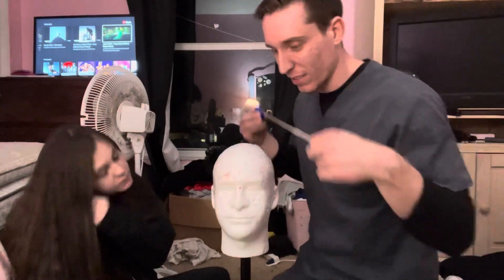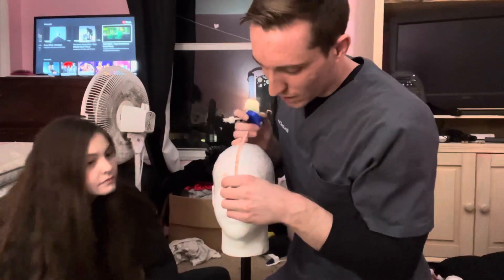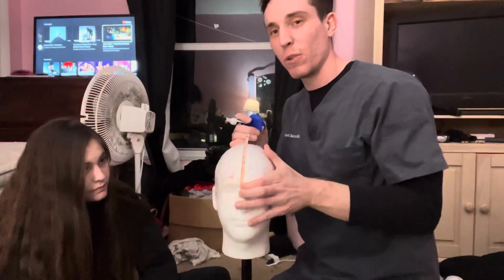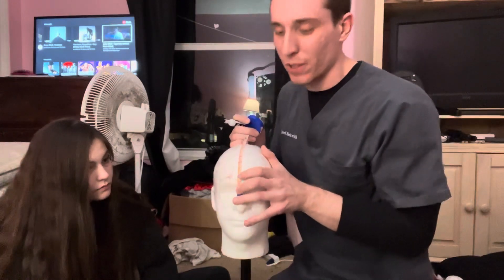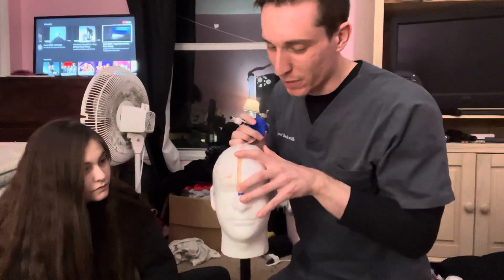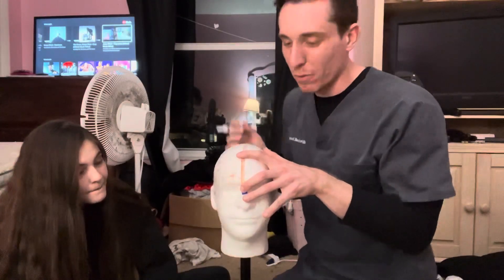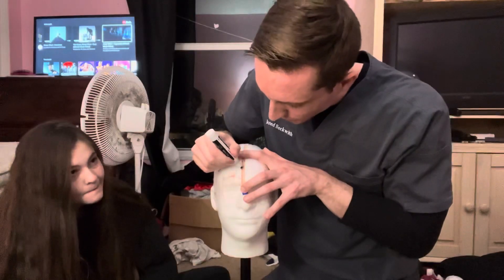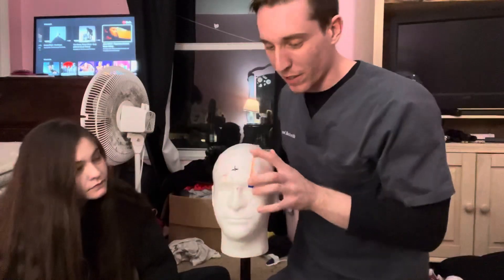That's a very important thing to know. Once I have that, I go back to the nasion. Since the full measurement from nasion to inion was 34 centimeters, you're going to want to go up 10% for the first measurement. 10% of 34 is just 3.4 — you just move the decimal over one spot. So make a mark at 3.4, which is going to be our FPZ mark.